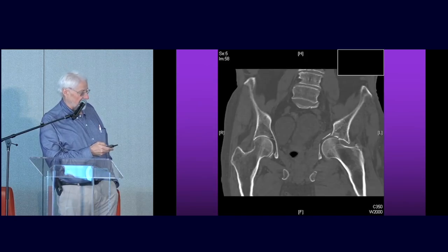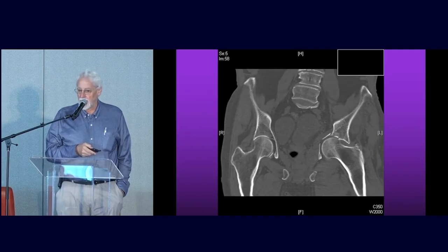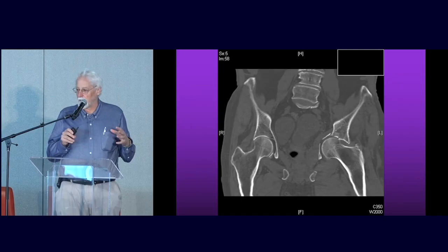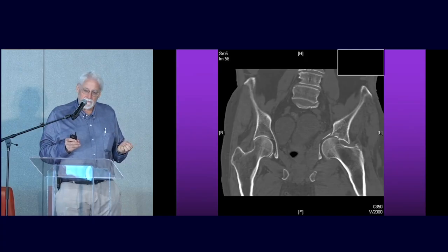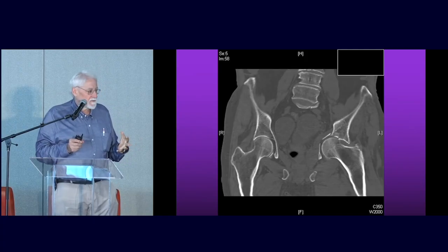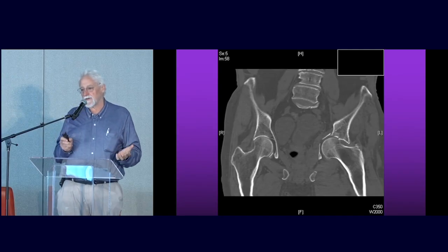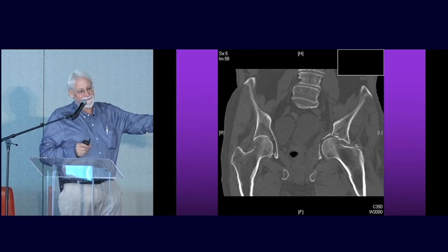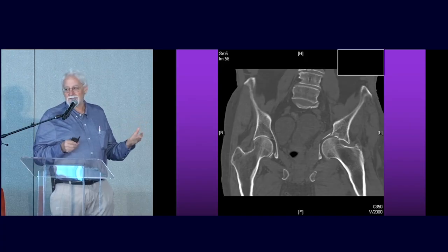So this is part of what he is absolutely saying, that there's been a couple of studies, and I'm going to have those, where people do a primary total hip. And there's a lot of criteria that's out there. And I always hate to be but the elephant in the room is some people are not as good as others at reducing them and keeping them fixed. I can reduce this, but I can't keep it. And so this is my classic indication.